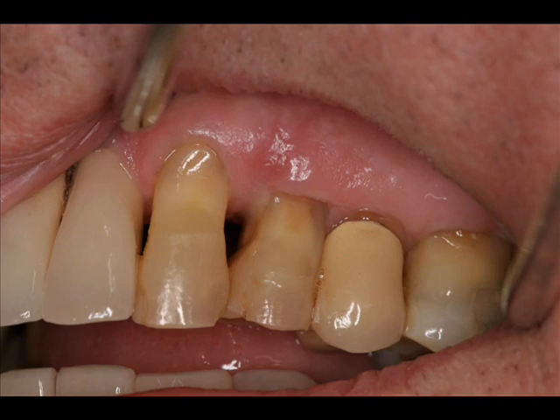It's this tooth. It's movable. It's got periodontal involvement. And so, today, Dr. Michael Zadil, down on Montague Street in Brooklyn Heights, Brooklyn, New York, he's going to take out the tooth and he's going to do a grafting procedure. He's going to put bone powder into the socket and then close it over, and the bone where the tooth was extracted from will heal in. It will serve as the base for an implant that eventually he's going to place.